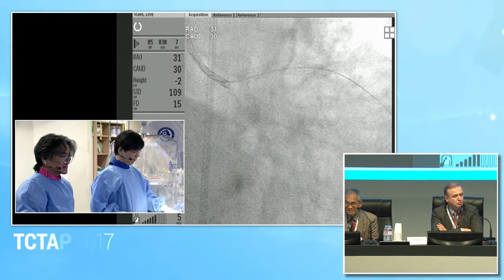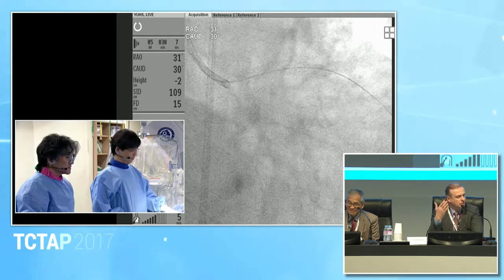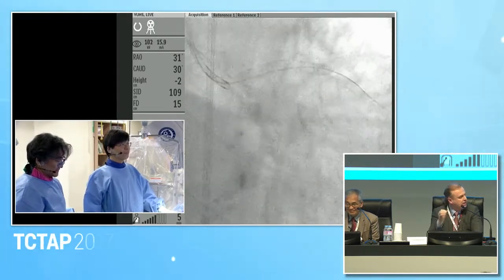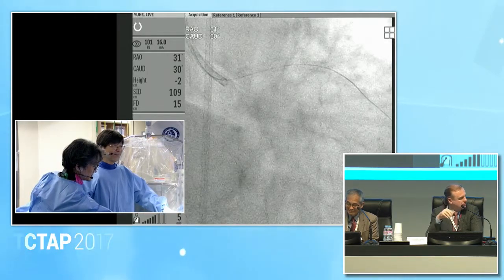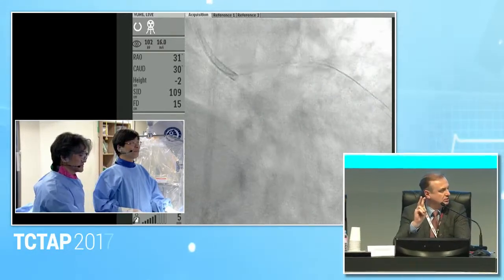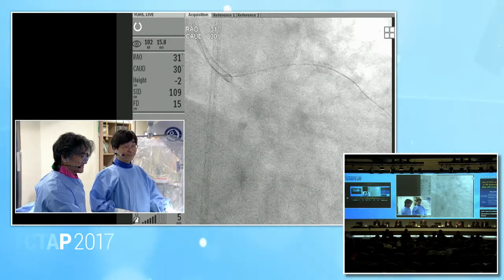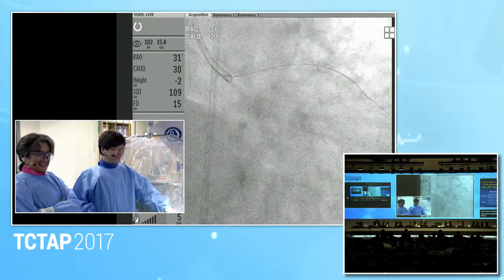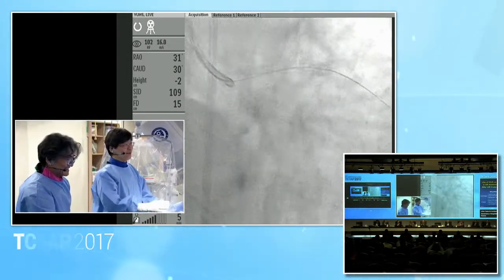If you speak theoretically, it's one thing. Actually, you can't do this because there are so many young fellows. You should not perforate with the wire. This is mandatory, at least so far. It's mandatory to do angio, at least in 2 projections without the wire. I agree on distal perforation or distal dissection. Please, let's finish this debate with just one single injection.